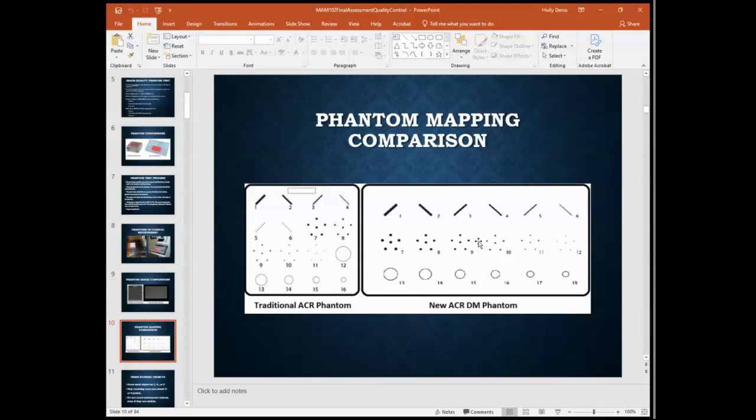Now, if you use the manufacturer's phantom, then they go straight across and they are 6 and 6 and 6. So that's something that you will need to remember. This is 6, 5, 5, and this is 6, 6, 6. So that's probably an easy one to remember, whereas with this one, you just got to remember the second two, or there's only 5 groups.